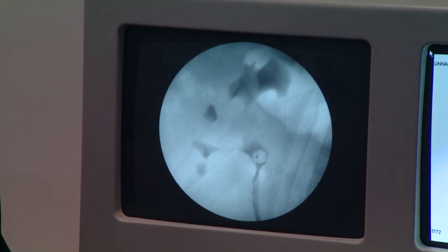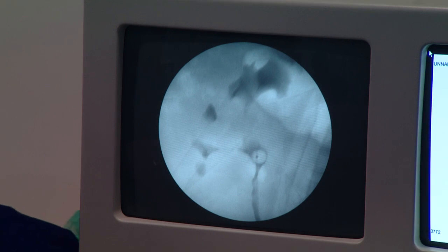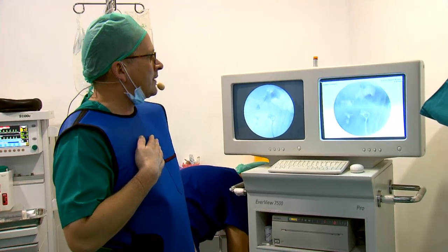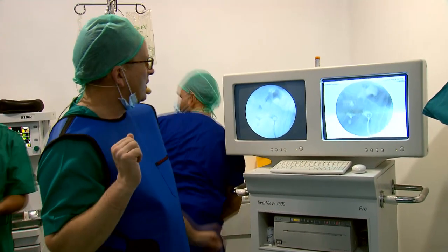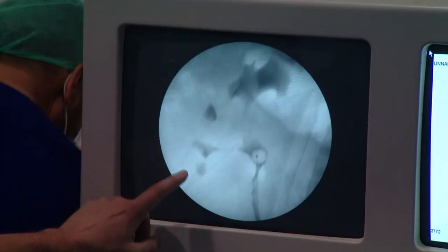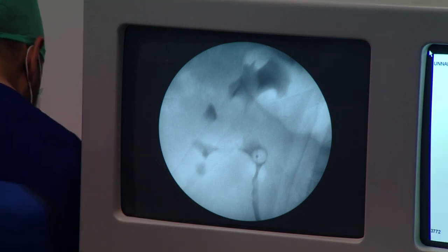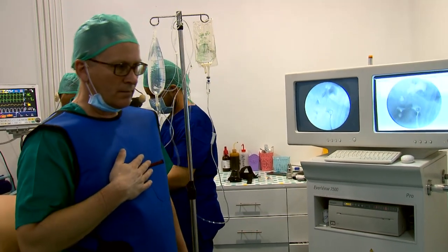We don't see the communication between the upper part of the calyx and the lower stone. There is a way to pass between both, but we don't see it from here. After we have the final position of the patient, we apply some contrast dye, and we can discuss this area once more. But from the current point of view, it is better to approach the lower calyx. Me, on the other hand, as you have said, I will approach it from the upper part.